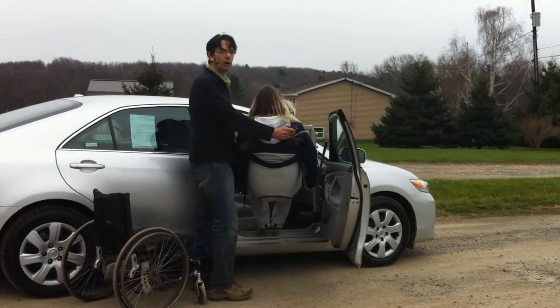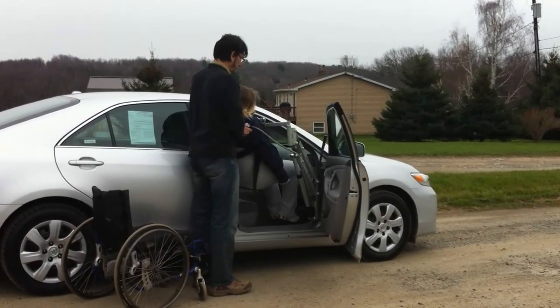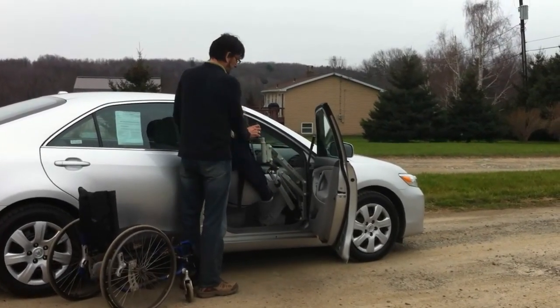Multi-Lift is available for home, car, and vehicle in conjunction with a portable base. There are lots of adaptations and lots of flexibility on this product.